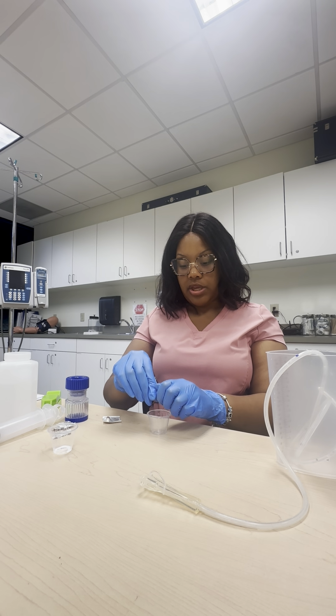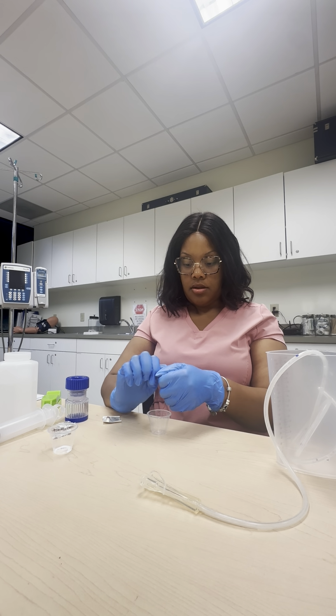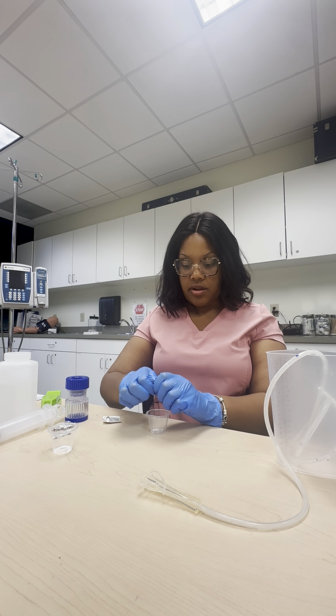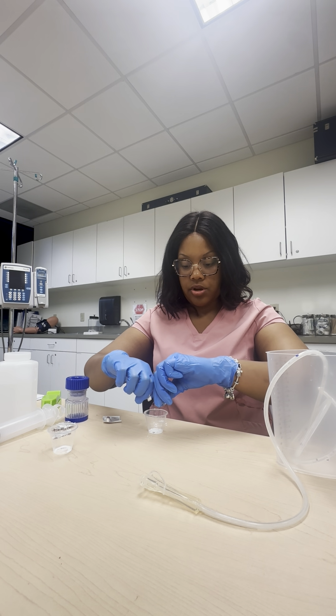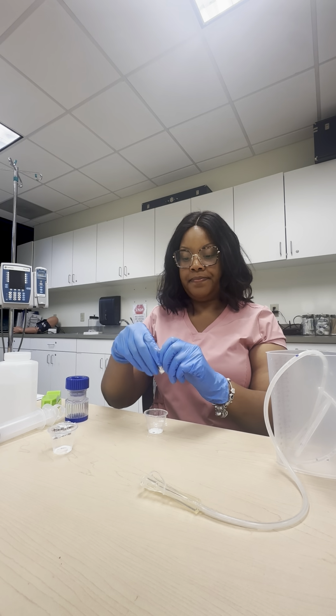So you just twist. All right, there it's coming. All right. Uh-oh, we spilled some, but it is okay because majority of it went in there. So you want to make sure we empty the capsules out. All right.